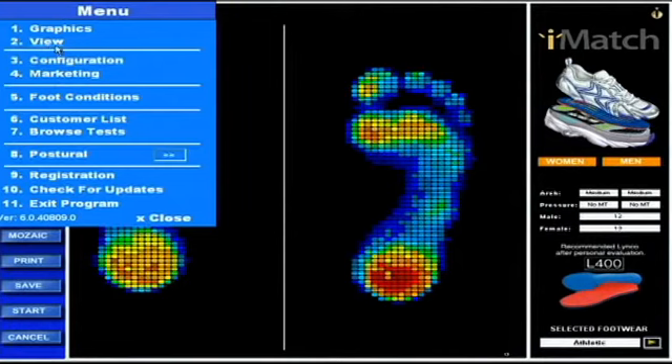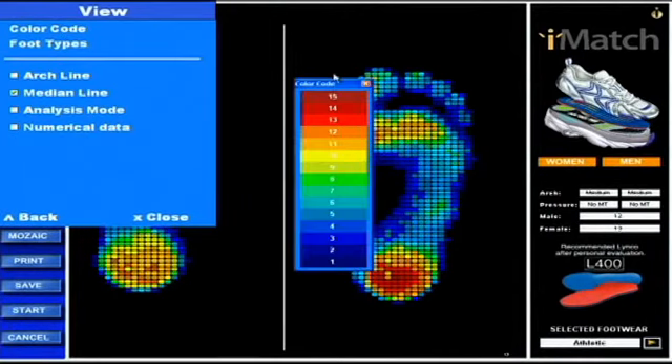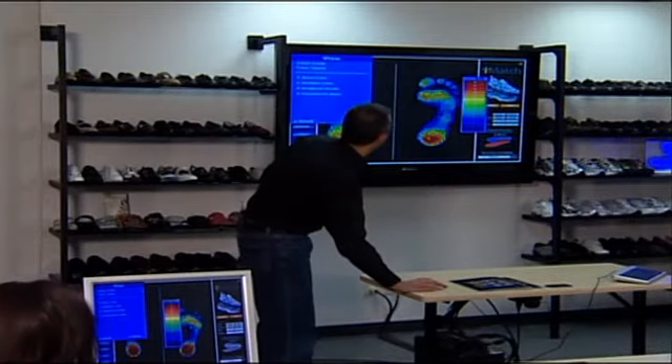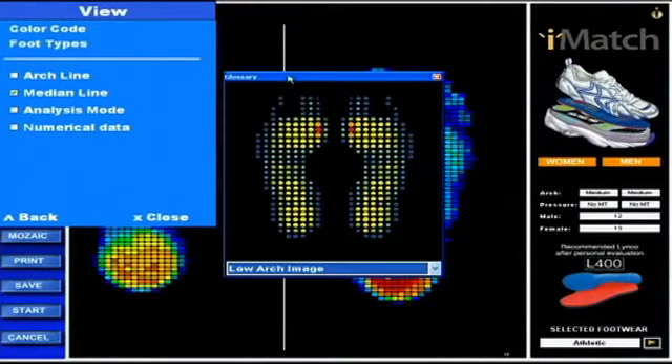Also in View, we're going to access the menu and click on color code. What this does is it's a tool you can pop up after you do a test to see what the 15 colors are in the spectrum. This can be helpful and can be turned on and off pretty quickly.